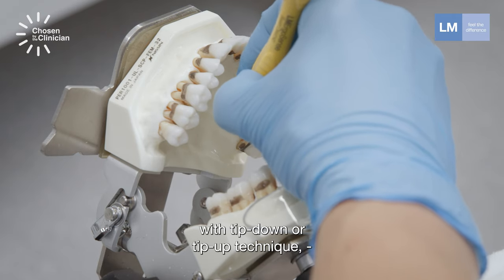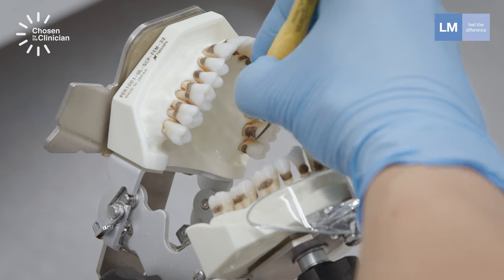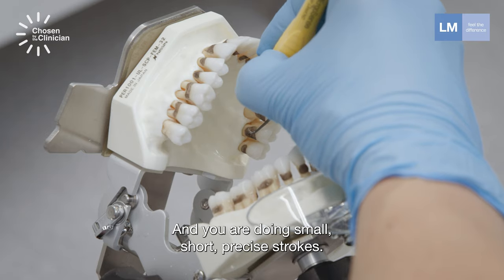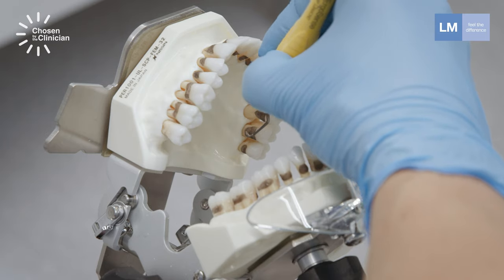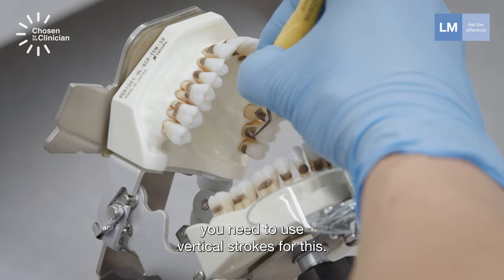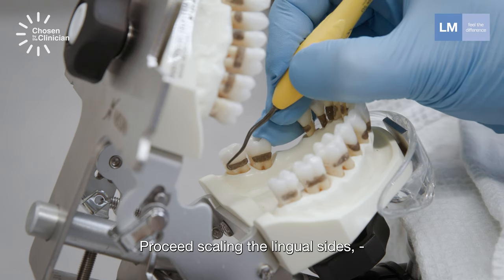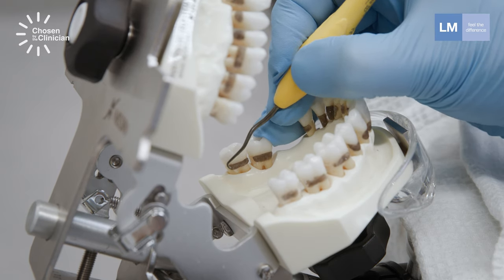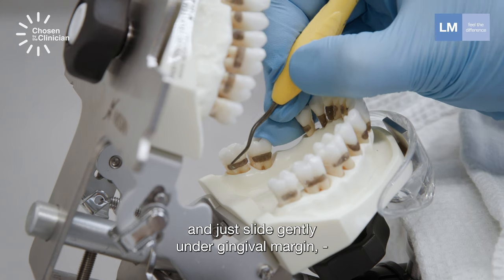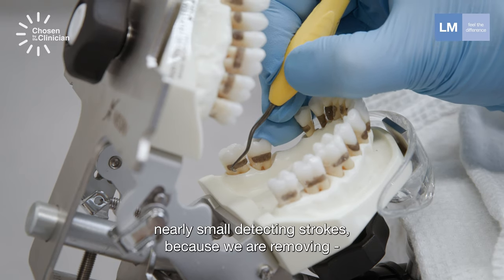With tip-down or tip-up technique, moving in the mesial direction and doing small, short, precise strokes. If there is a need to scale deep pockets, you need to use vertical strokes for this. Proceed scaling the lingual sides, moving the toe of the instrument in the mesial direction and just sliding gently under the gingival margin with nearly small detecting strokes.